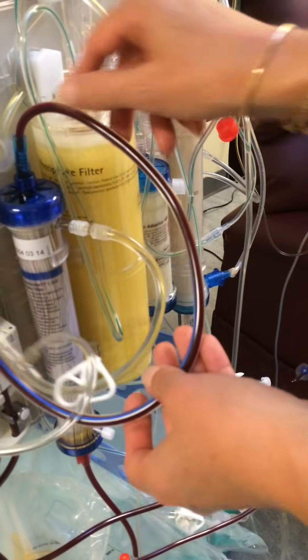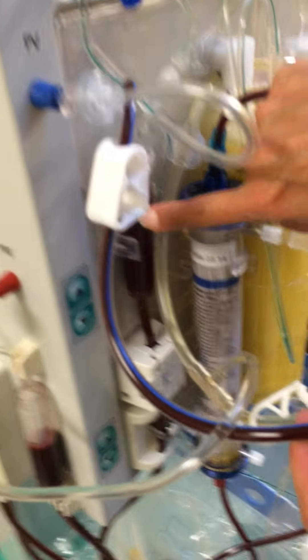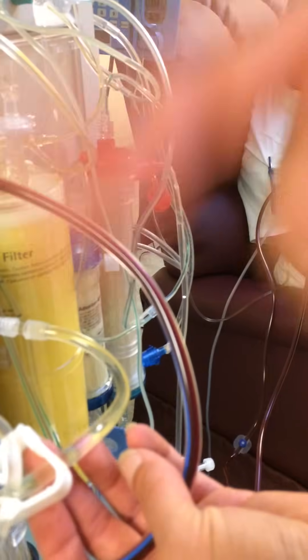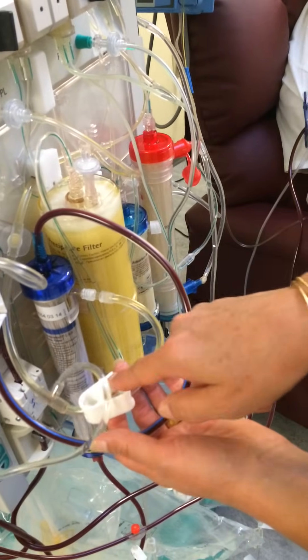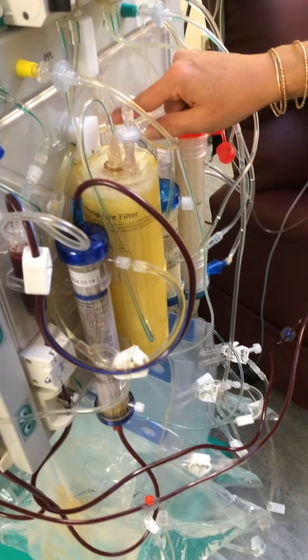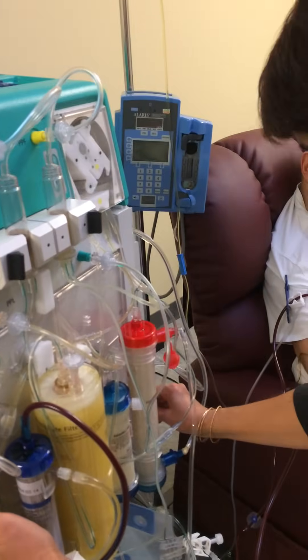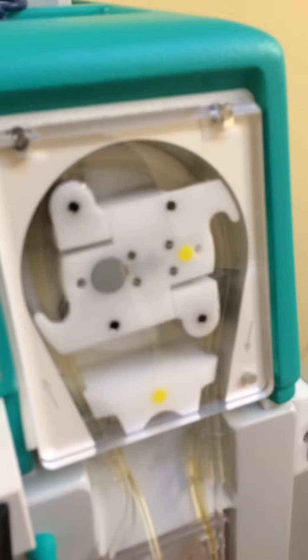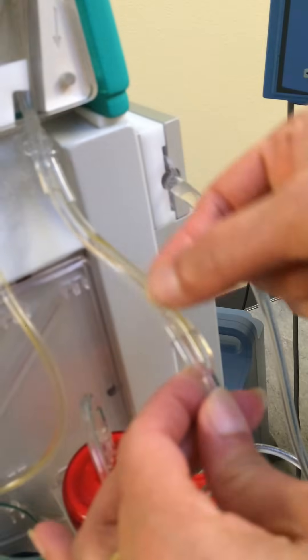Red blood cells exit out here and are held in the venous chamber. Concurrently and very rapidly, the plasma is exiting out here, going through a blood leak detector, then circulating up to the plasma buffer pump. Right here, the patient's plasma joins another fluid brought up from down below.